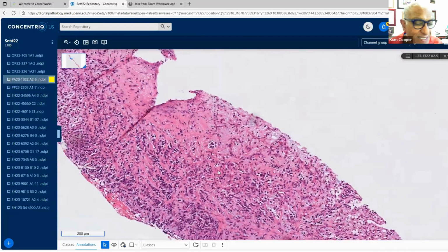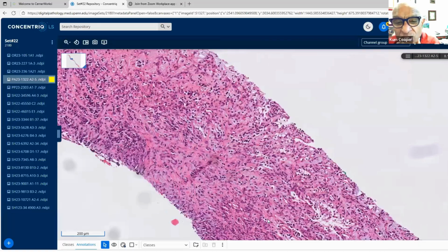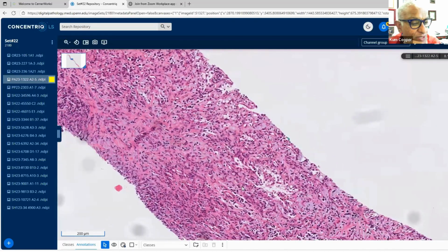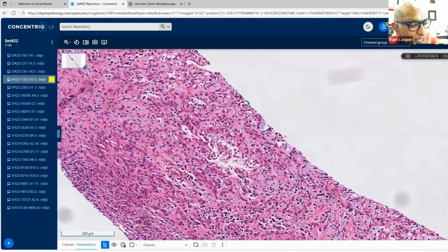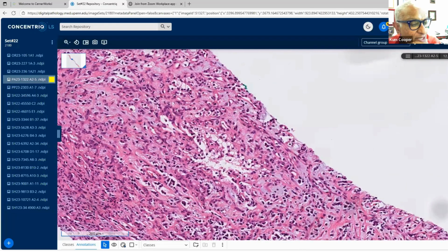And so that is the trick to this, is that you have to look very carefully. And now I'm going to show you areas very closely, very carefully, and you'll see. Myxoinflammatory fibroblastic sarcoma would be something that's typically in the extremities. I mean, they were first described in the acral distribution, and then they've been described in more proximal areas.